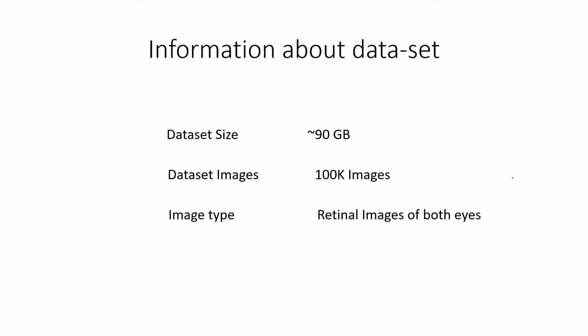So some information about our data set is our data set size is almost 90 gigabytes. We have almost 100k images, and the images are of retinal image of both eyes as shown earlier.